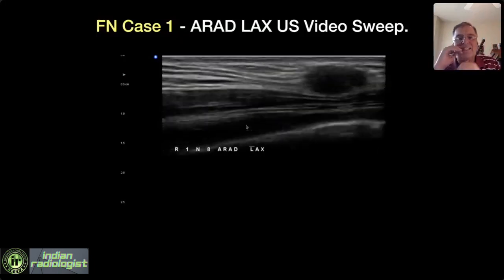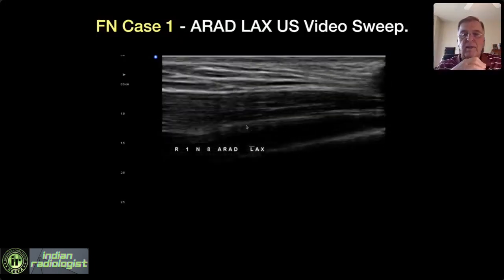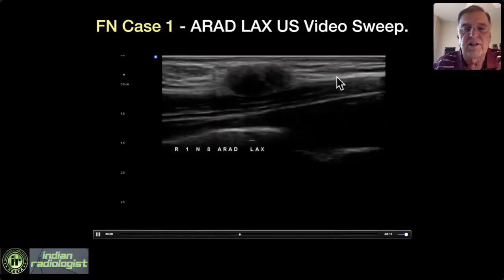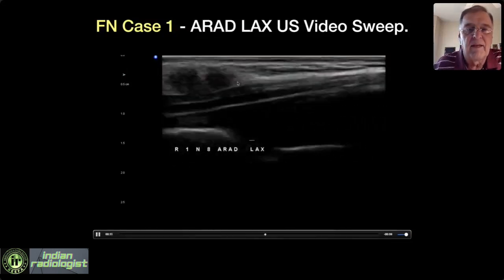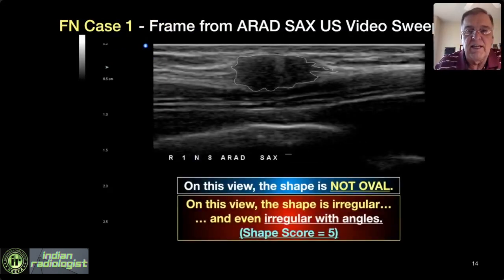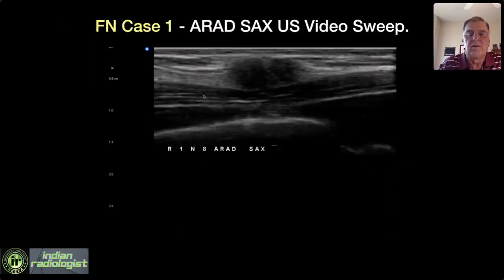Here's a long axis video loop. Notice the hyperechoic spiculations — the readers just flat didn't see that. This is not an oval shape; when I draw the region of interest, this is highly irregular. It has a thin capsule on front and a thin capsule on the back, but a thick, ill-defined echogenic rim on the ends and hyperechoic peripheral zone spicules. There's a lot there that's not reassuring.